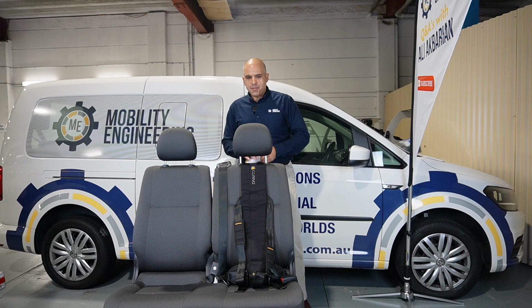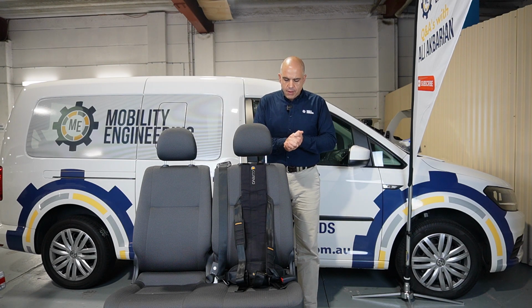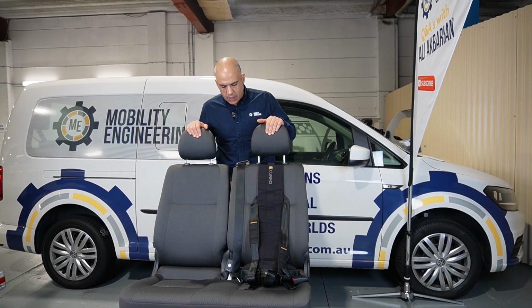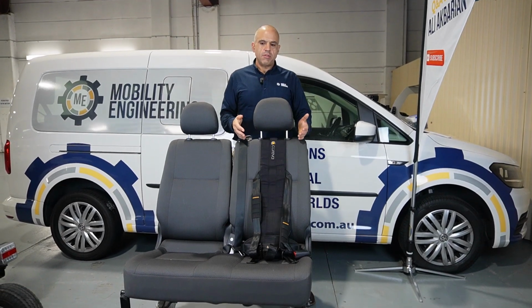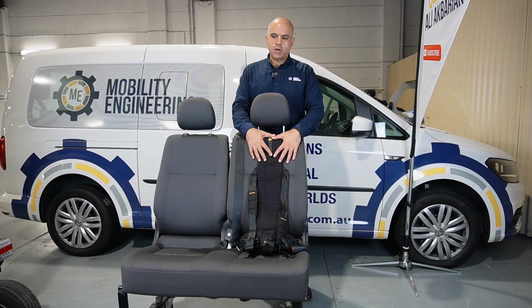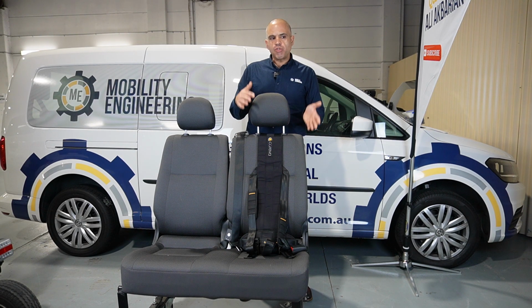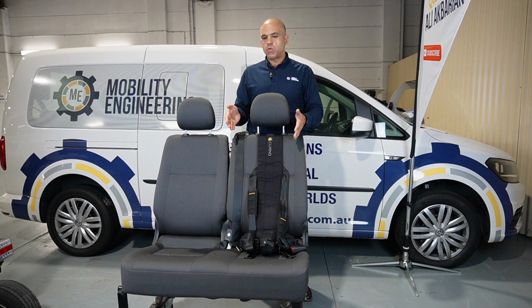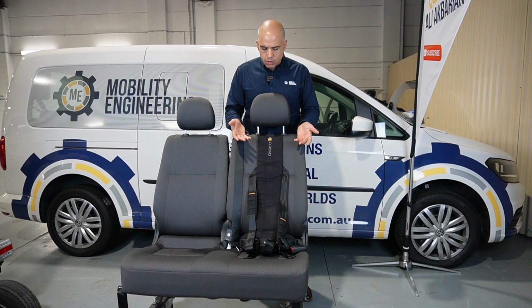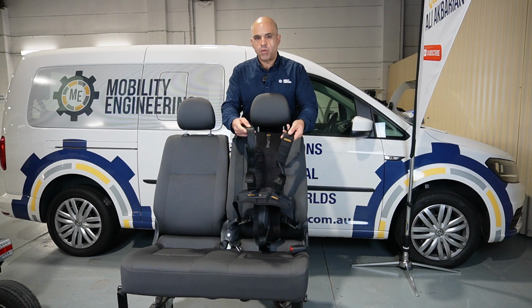But anyway, flag distractions aside, let's get on to today's question. So we have a postural harness, a Careva postural harness here, which is quite a popular postural harness. This question is, can I fit my postural harness in a sedan vehicle? This question can also be transferred over for behavioural harnesses as well. Within the disability and mobility industry, we have these harness type products, which are called postural harnesses, and we also have behavioural harnesses.